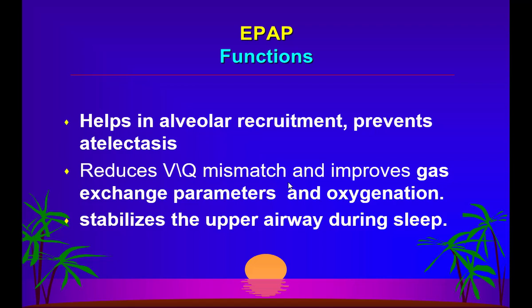So what you do, you set the EPAP in a way that the patient starts to trigger the machine. You can see now the inspiratory phase is coming up. How is it done? It opens up the terminal airways. Suppose your auto PEEP is 10 or maybe 8, then once you set the EPAP of 6, it opens the terminal airways and the air gushes out, and then the diaphragm goes up and the patient is able to breathe in. Patient is able to trigger the machine.